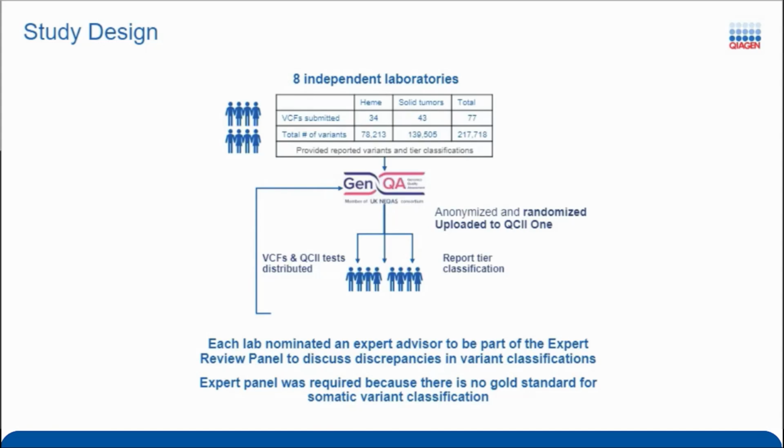Sure. So I think, generally speaking, the question is like, how does this help, right? And it would be great if it was a super simple answer, but clinical decision support software is a tool. This is a way to help a variant scientist, to help geneticists actually make better sense of what it is that they're looking at, right? You're getting bombarded with information. You need to stay on top of that information. And so the one question, does it save time? The answer sadly is yes and no, right? But there's good reasons to think about that.